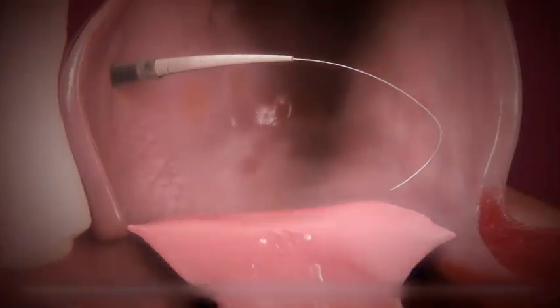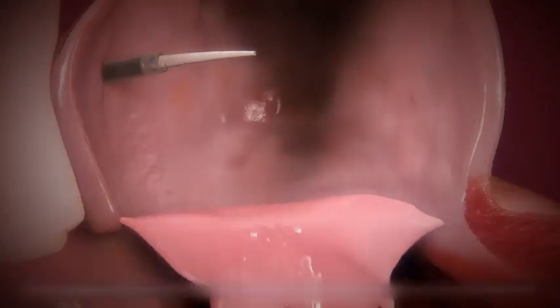MitraClip's steerable guide catheter is introduced over a previously placed guide wire. The dilator is used to gradually advance the guide into the left atrium, and the guide wire and dilator are removed.